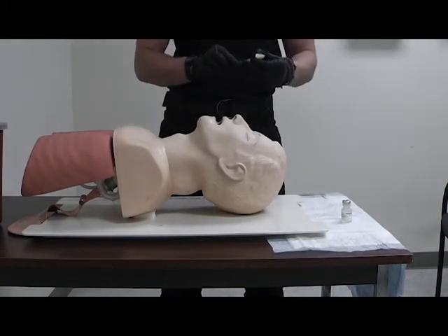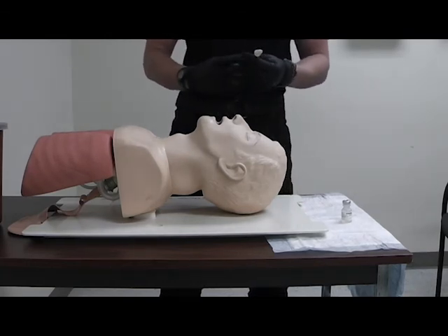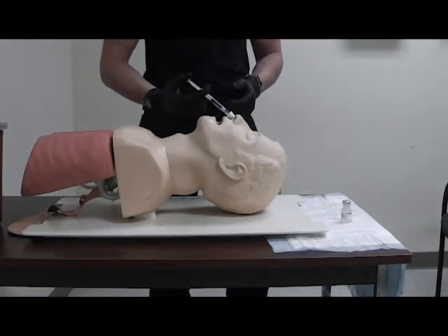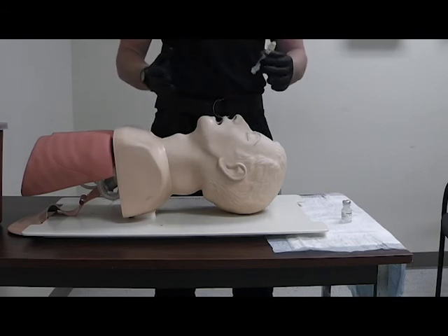Attach the MAD device. Administer half a dose, which is going to be one milliliter per nare. It's not sharps, so you don't sharps it in.